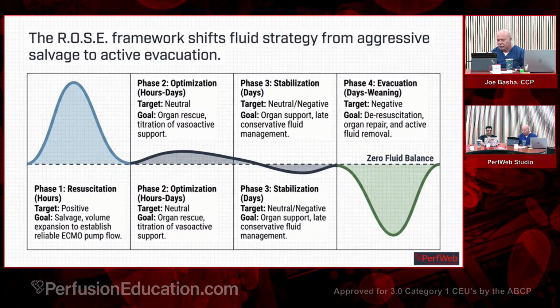Yes, exactly. So in this ROSE framework, which is resuscitation, optimization, stabilization, and evacuation, you have salvage, volume expansion to establish reliable ECMO pump flow. We discussed this already. So this is your resuscitation phase. And then you want to optimize over time.